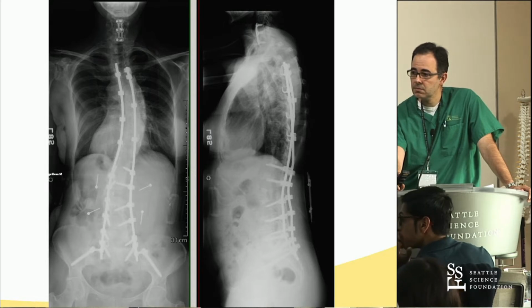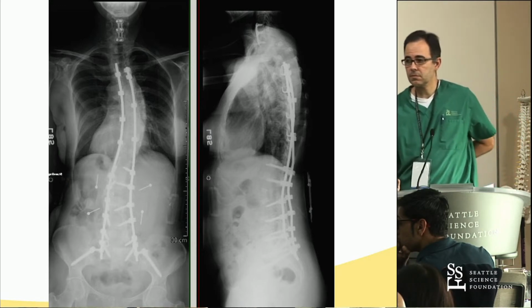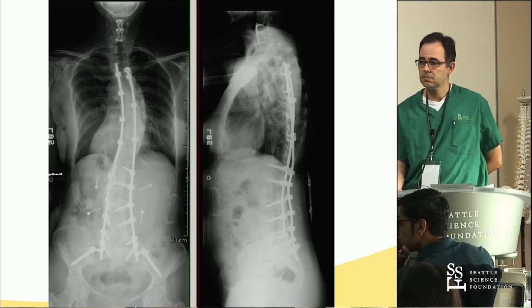And the second thing is that, if you're working to get lordosis, having those pelvic screws in at the base really helps, and that's really the fulcrum or the lever for the correction. So I like it for that reason as well. I've tried doing it with just one screw in some of those cases, and I'm back to using bilateral screws. I just think I have a better construct and better durability.